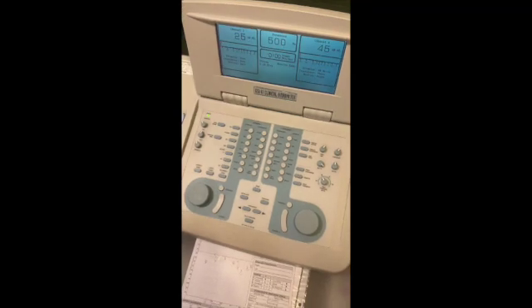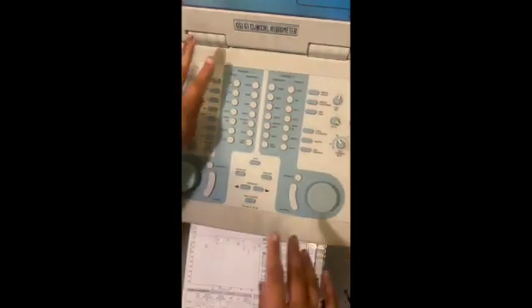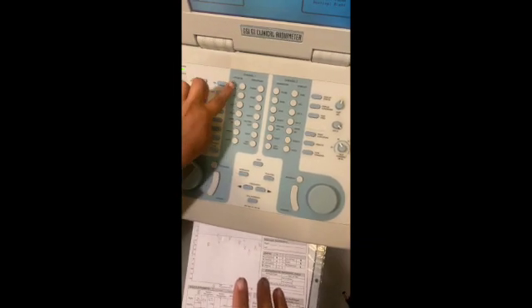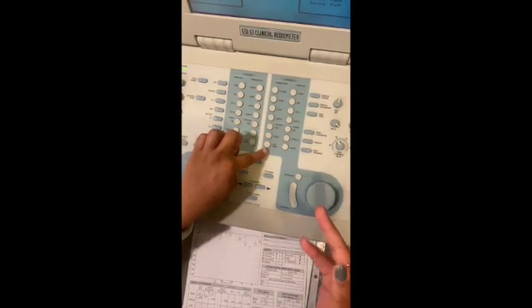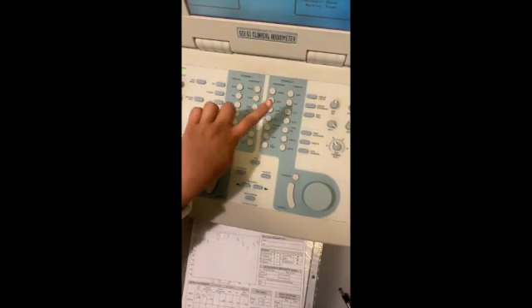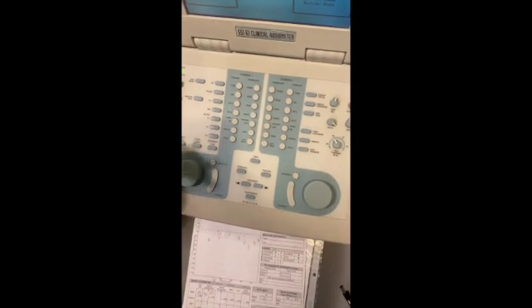Okay, so we'll begin setting up the audiometer to mask for 500 Hertz. So in channel 1, your test ear, that will be your left ear in this case, you're going to set it to tone and bone. And then in channel 2, which is your non-test ear or your right ear in this case, you're going to set that at narrowband noise, not tone, and phone, since we will be using headphones in this instance.